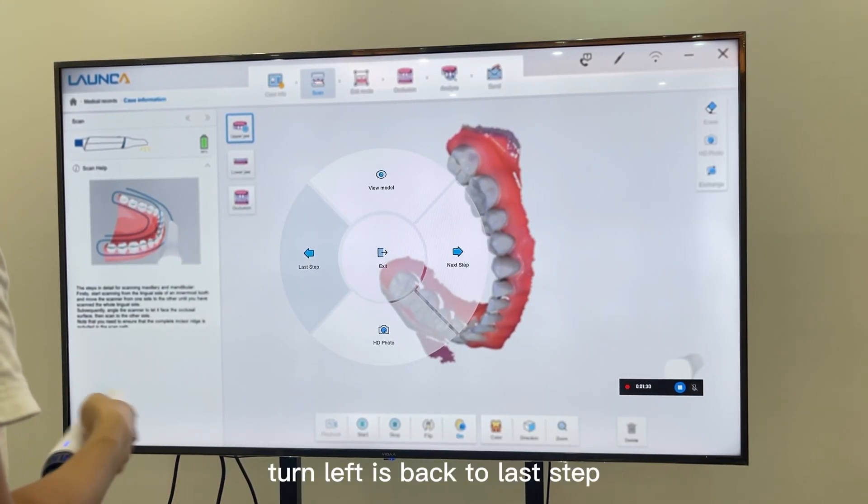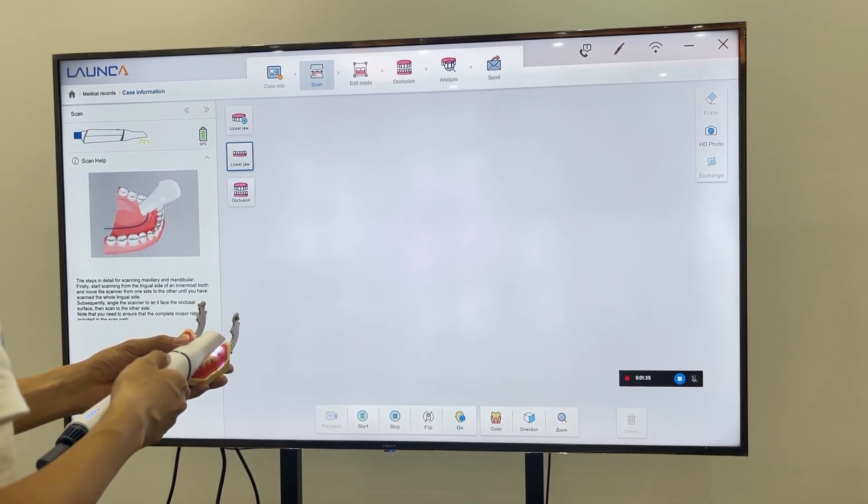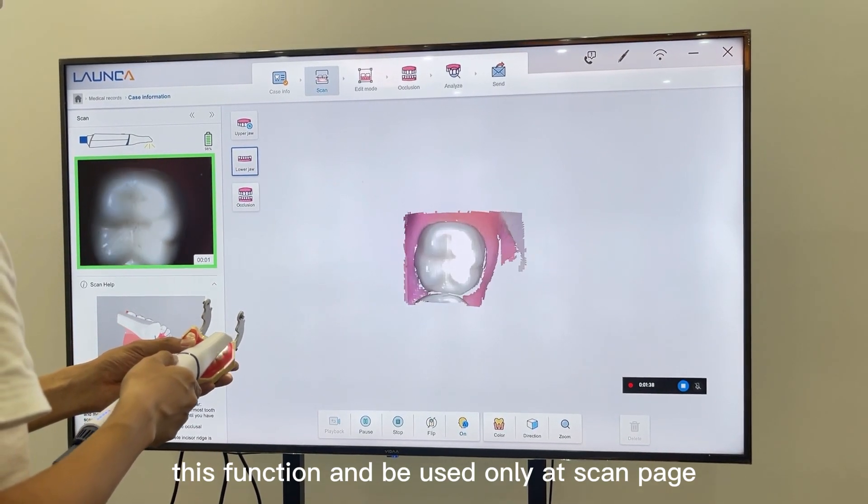Turn left is to go back to the last step, and turn right is to go to the next step. This function can be used only on the scan page.